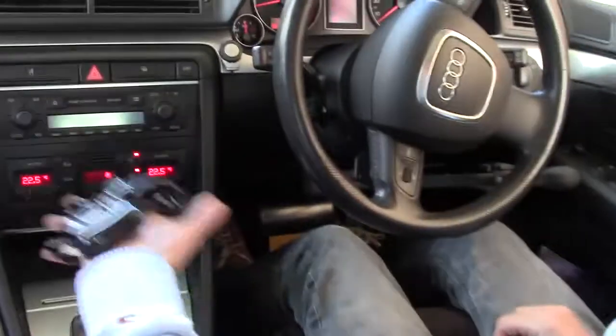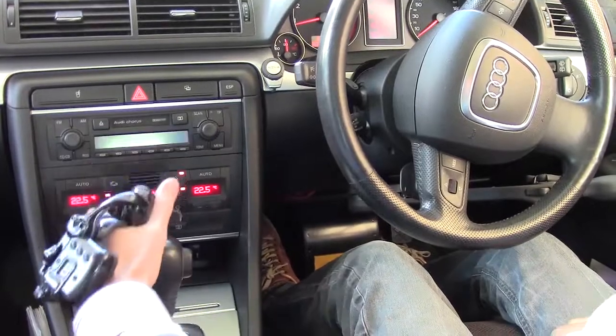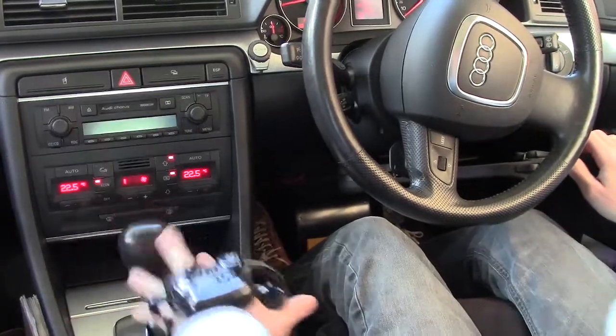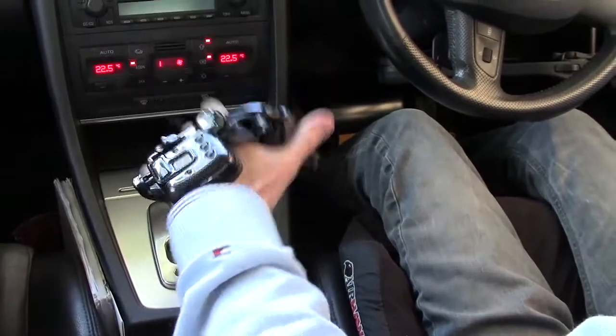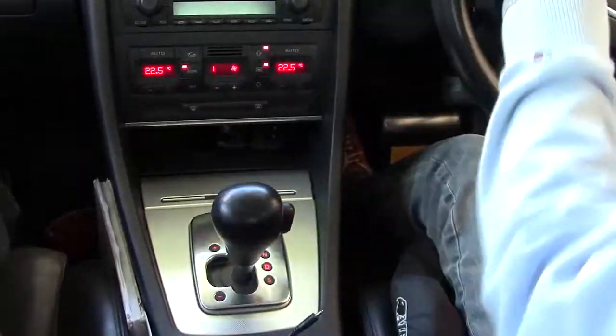There are a few techniques when you want to operate the radio or change the air conditioning — you can be accelerating at the same time. To change gear, here's my index finger, and I don't actually take my finger away from the thumb.